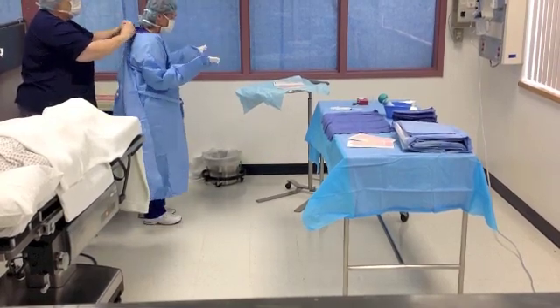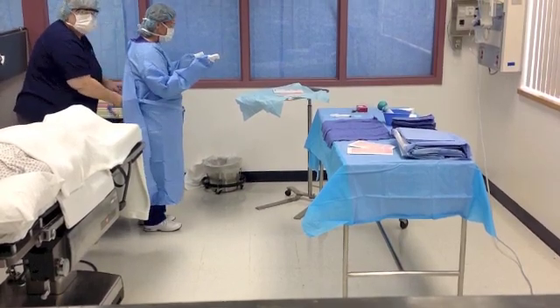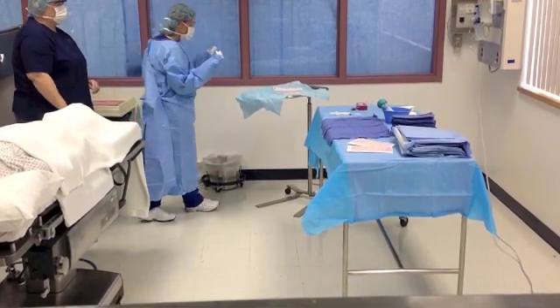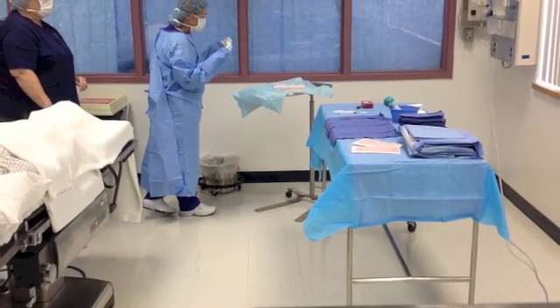Advance your hands into the sleeves by pushing them horizontally and outward until your fingertips reach the white cuff. The circulator can assist you by grasping the inside of the gown and securing the back. Your fingertips must stay inside the white cuff within one inch from the opening.